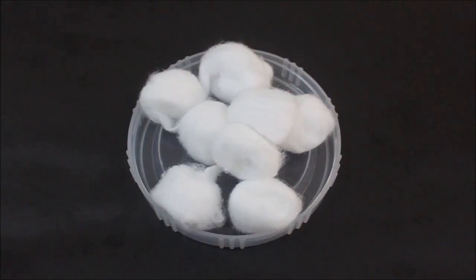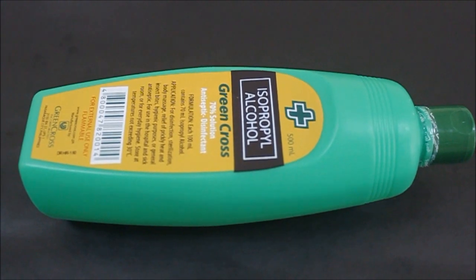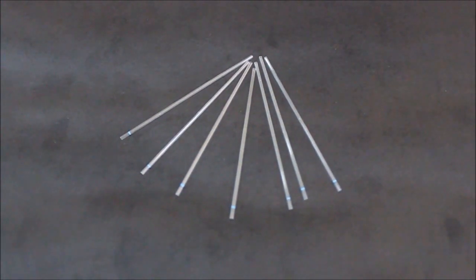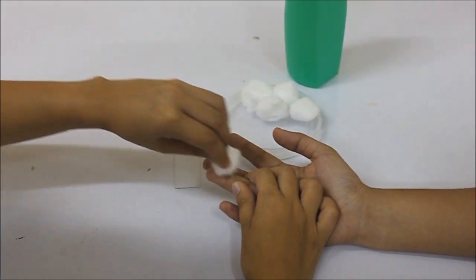You need lancet, cotton, 70% alcohol, timer, clean glass slides for slide method, and non-heparinized capillary tubes for capillary method. To perform the slide method, first do a capillary puncture.